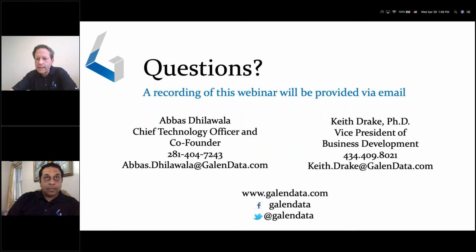And here's a follow-up to one of the previous questions. As a follow-up, would the API generally support most Wi-Fi microcontrollers transmitting FHIR standard JSON documents? Let me answer it in two parts. One is, as long as you have Wi-Fi or some kind of internet connectivity, whether it be Wi-Fi or cellular, that's all we need. We don't necessarily worry about the microcontrollers.